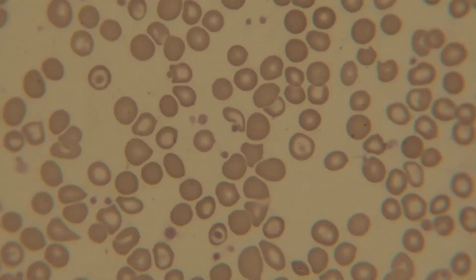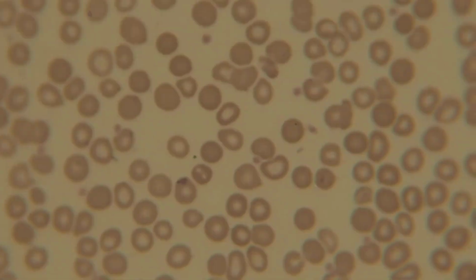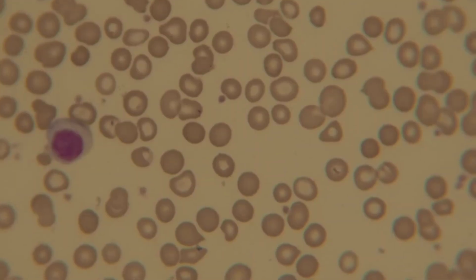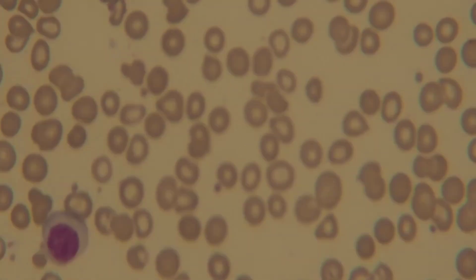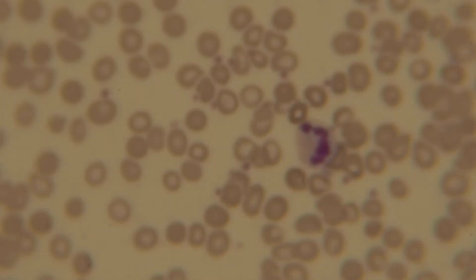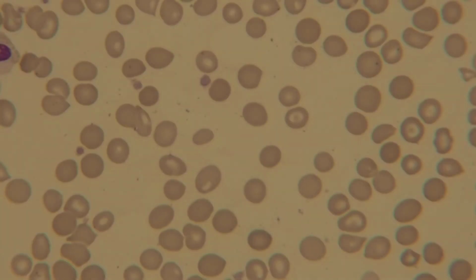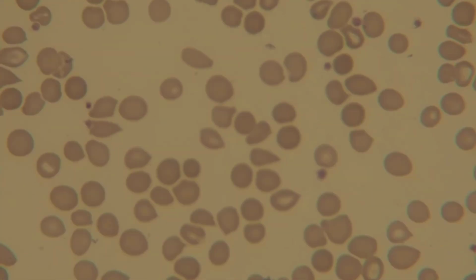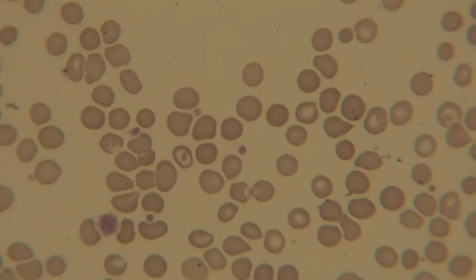Neutrophil, lymphocyte, neutrophil, neutrophil, neutrophil, neutrophil. Large platelet, not a cell.